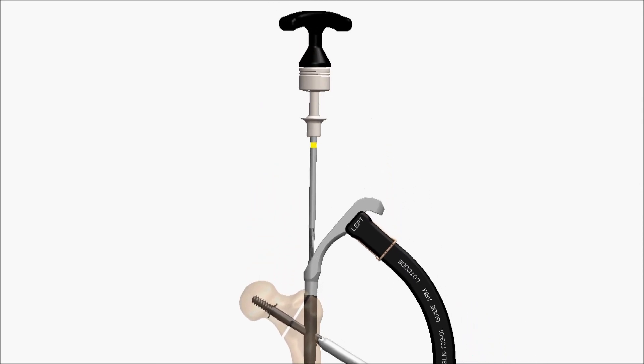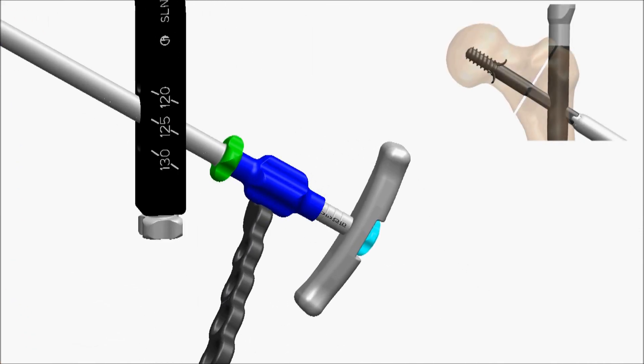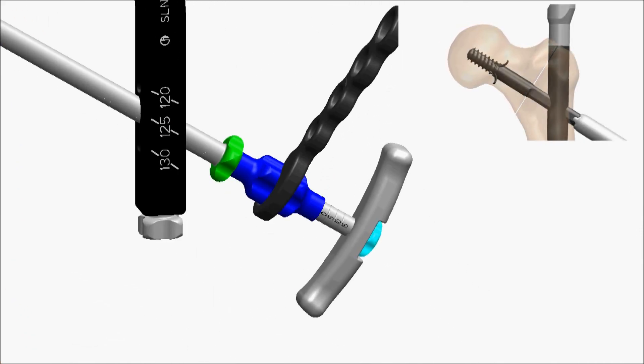Loosen the set screw one half turn. If appropriate, apply compression by turning the compression knob clockwise using the knob wrench.